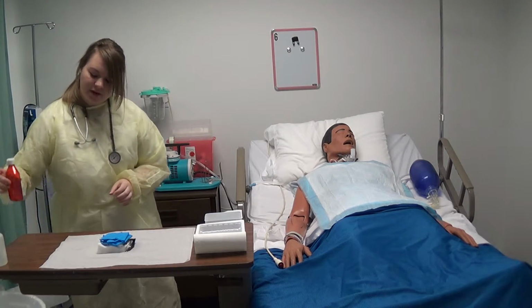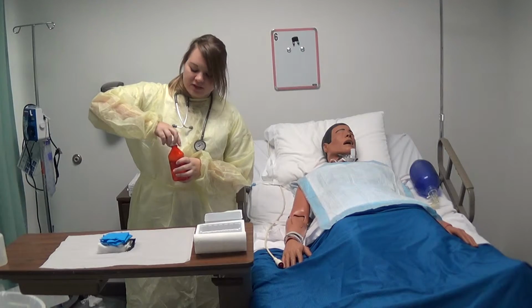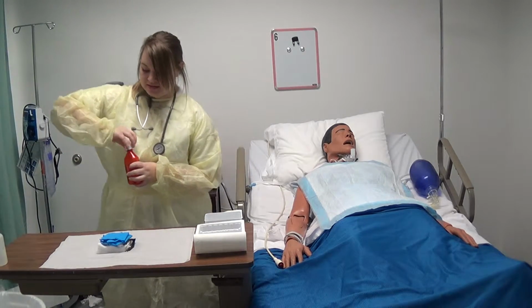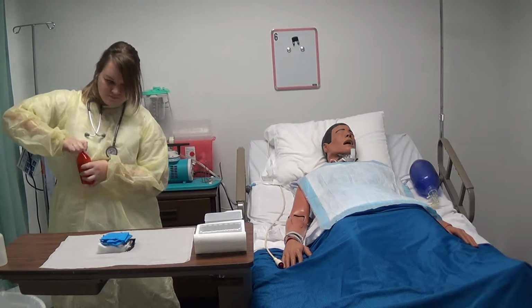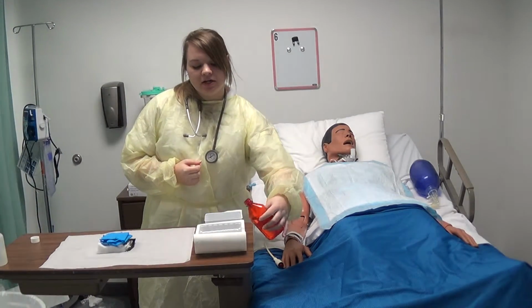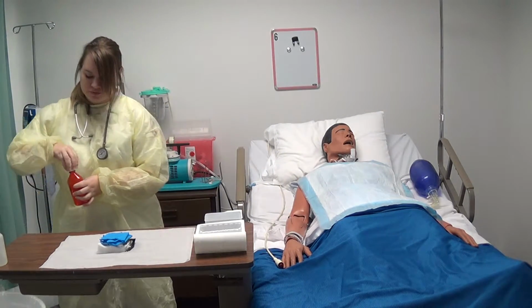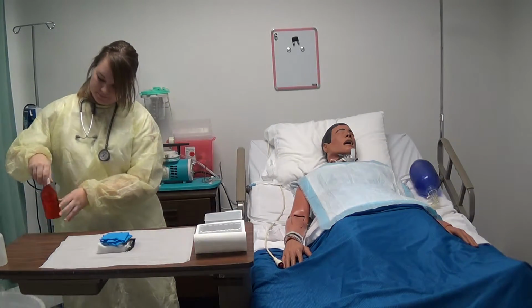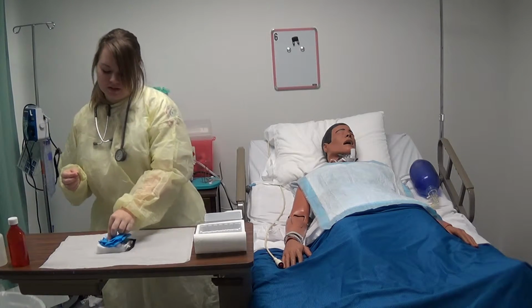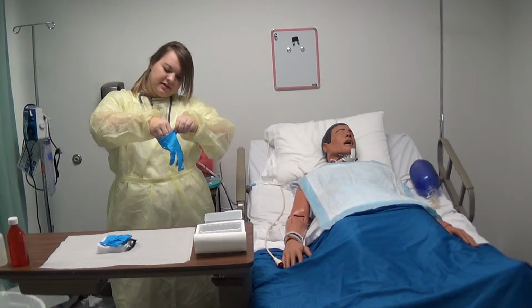I have a brand new bottle of hydrogen peroxide that I'm going to use. When I'm done, I'm going to date and initial this. I'm going to pour that in my bigger container. It's going to be equal parts, 50-50, of normal saline and hydrogen peroxide. These are my sterile gloves.